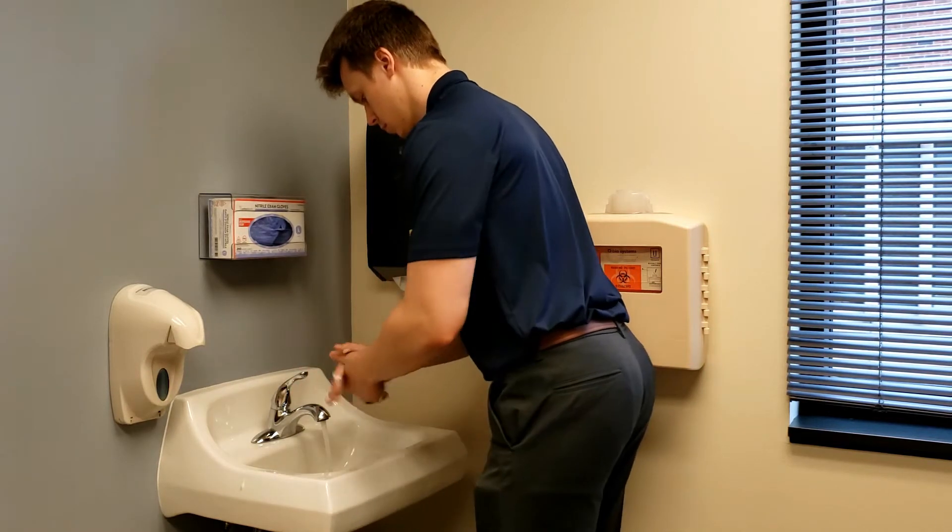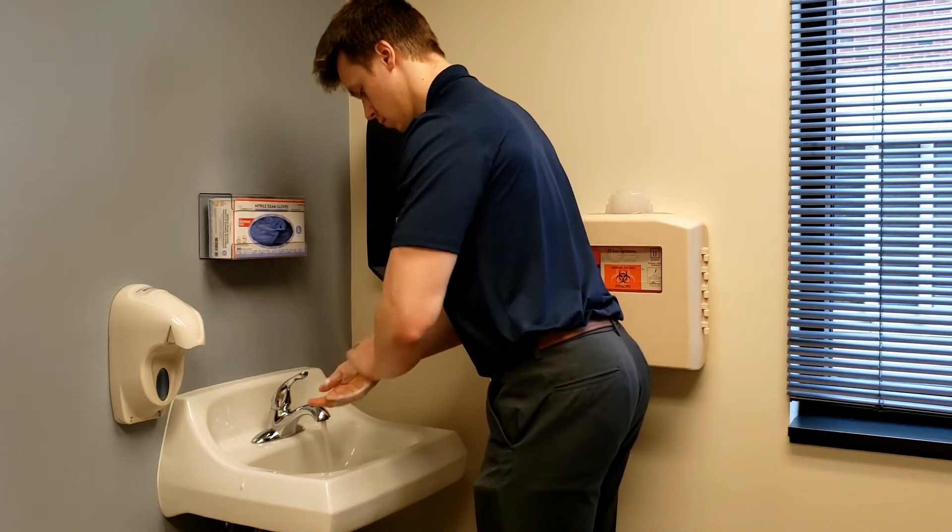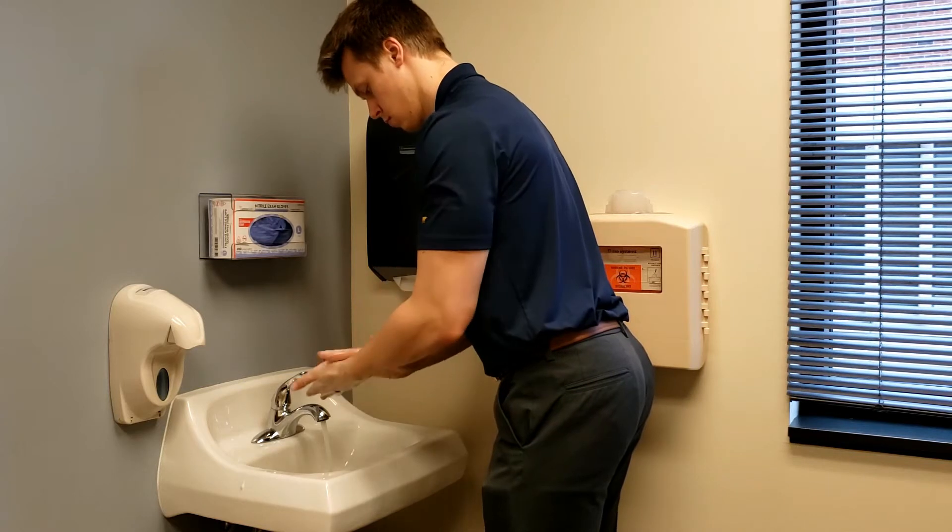Before administering insulin, it is always important to wash your hands with soap and water.